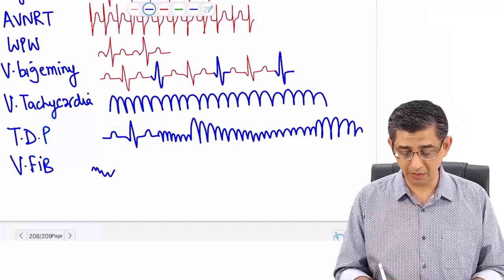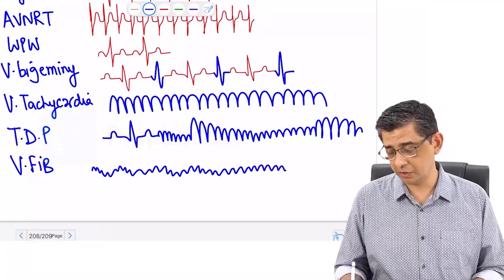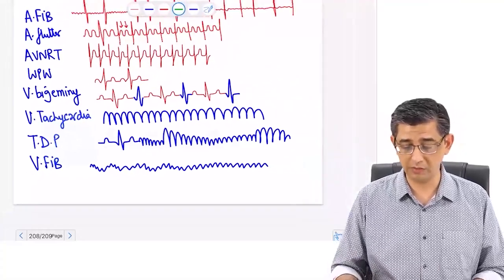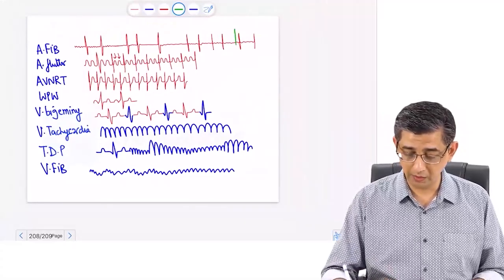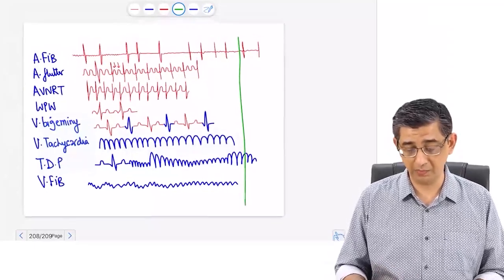And ventricular fibrillation is anyway one of the easiest ones to identify, and there would be a patient who would be pulseless, and for ventricular fibrillation per se there would be no drug of choice as well. Once you have hand drawn this activity, we will also put in the same discussion the drugs that will test your pharmacology and presence of mind as well.